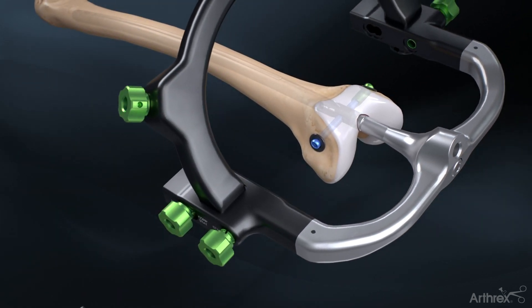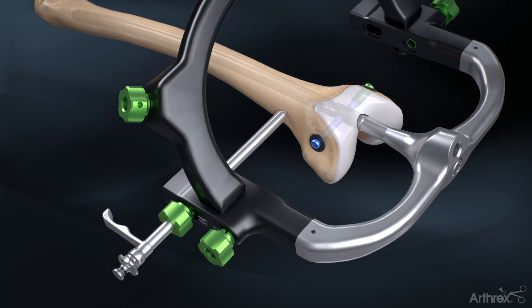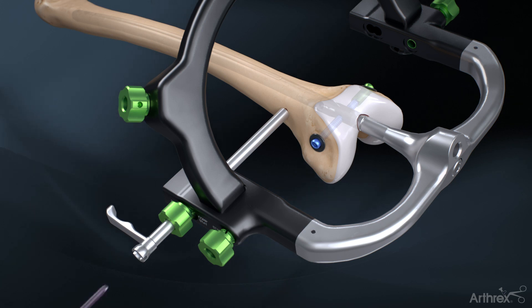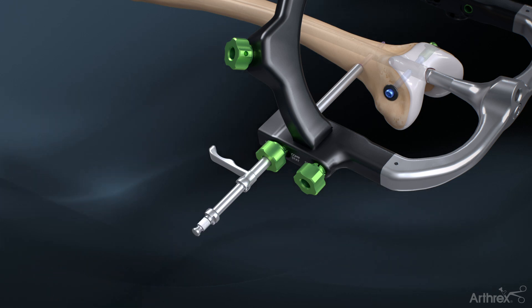Insert the screw sheath, drill guide and obturator assembly through the proximal lateral hole until it contacts with the lateral cortex. Remove the inner trocar and drill bicortically with a 5.5 mm drill, using the calibration marks on the drill to determine depth. Insert the 6.5 mm cortical or cancellous screw using the 5.0 mm hex driver, using the laser mark on the driver to determine depth, and remove the screw sleeve.